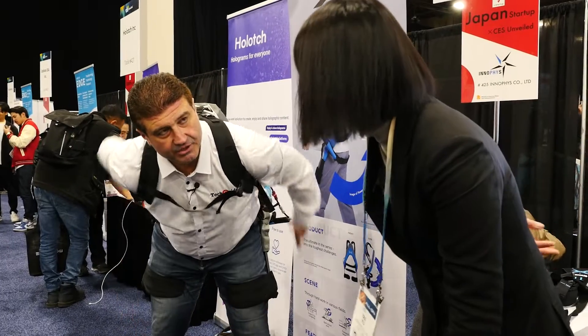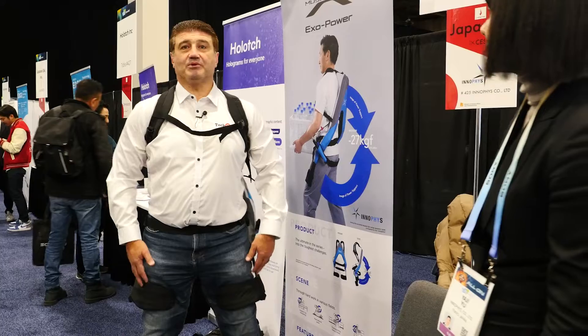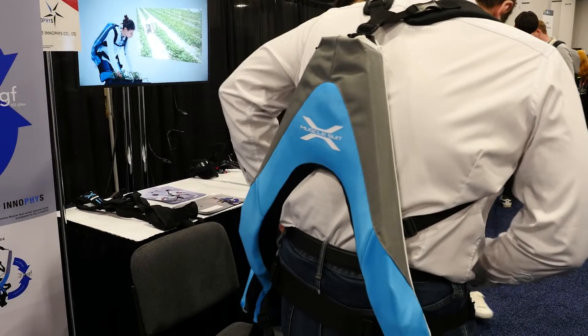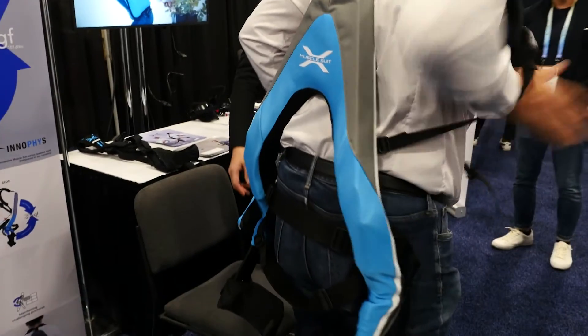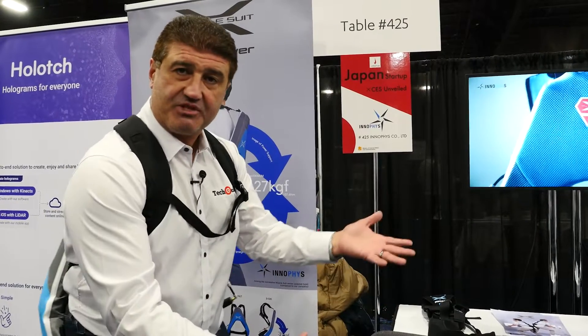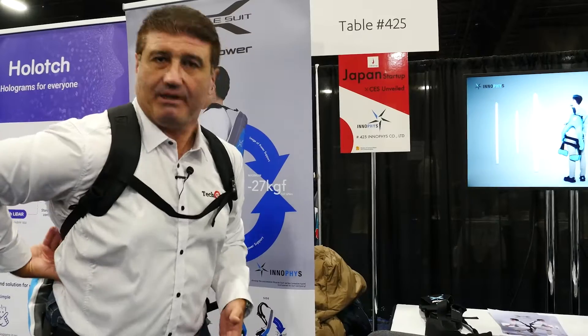I'm wearing it now and I can actually feel the support it's giving me in my lower back, allowing me to lift an object up to about 27 kilos and stand up straight with it. You can imagine someone working in a factory lifting a heavy object, or a caregiver moving a patient in and out of bed or adjusting their position — this is the product that can help them keep their back healthy.